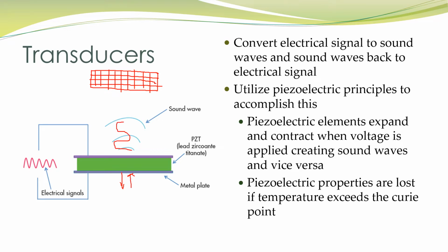So if I look at the transducer face, it would have many little piezoelectric elements. Each of those piezoelectric elements is going to have its own voltage signal through a particular channel. So by applying a voltage through a channel to an element, I can create a sound wave.